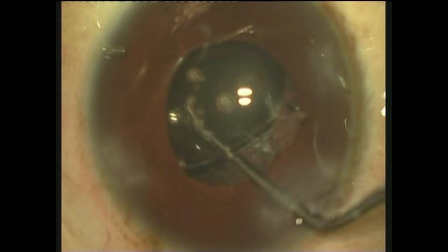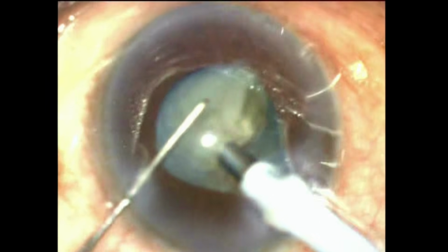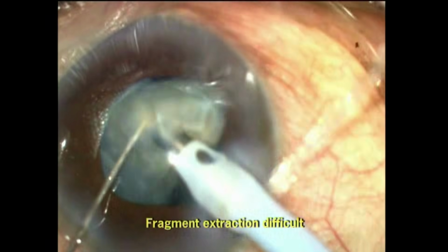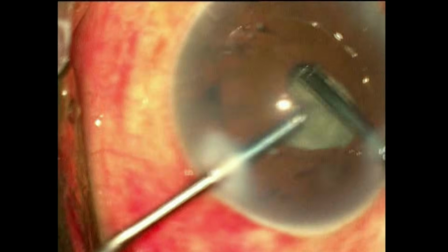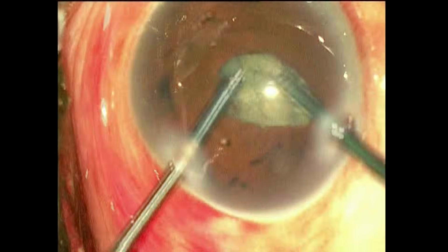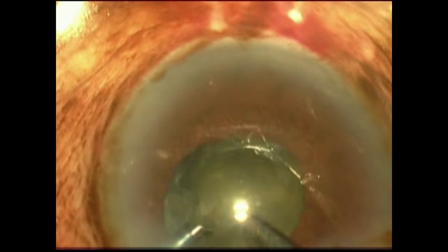insertion. It can pose challenges by limiting access to the surgical field, cause iris trauma, increase inflammation, zonular dialysis, posterior capsular rupture, nucleus drop, and retained lens material. A well-dilated pupil is a gateway to a successful and smooth cataract surgery. However, the cataract surgeon might not always be lucky enough.